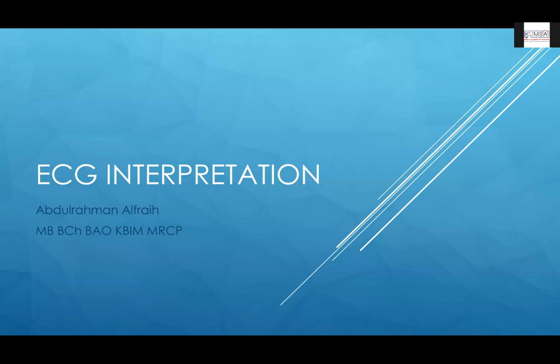I'm an internal medicine senior registrar in Kuwait, and I'm pursuing my cardiology fellowship starting in July. Based on my understanding, you're all medical students in the UK and a few other places. So I guess this session is probably more for the basics of ECG and different types of ECGs and just a systematic way of interpreting everything.